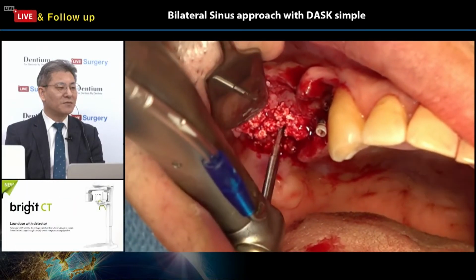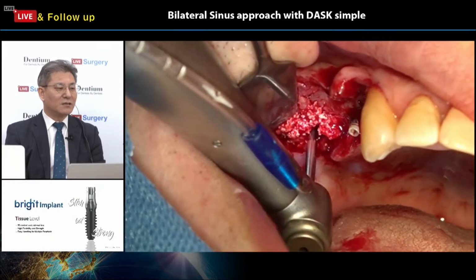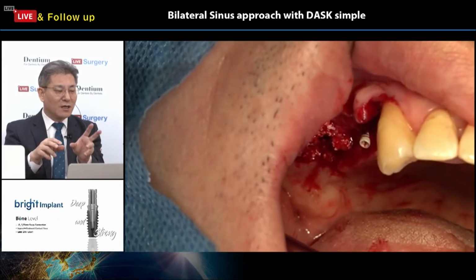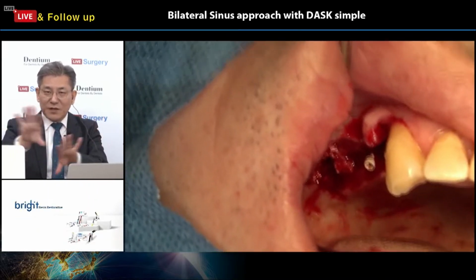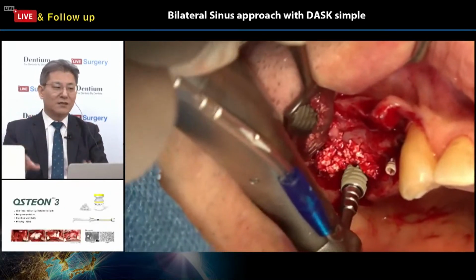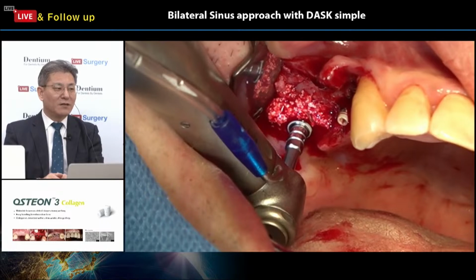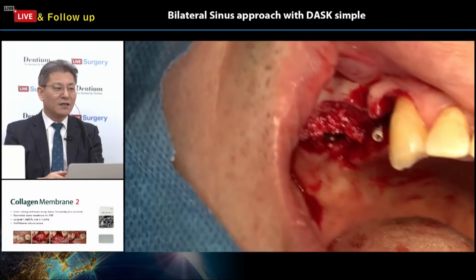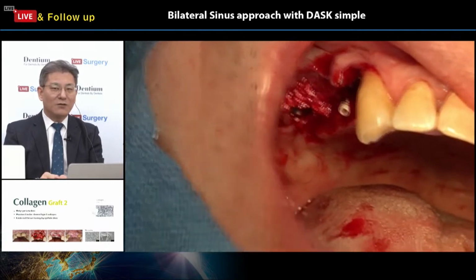This one is a graft spreader. It is one of the options. The purpose of using the graft spreader is to spread the graft materials into the sinus cavity in different directions. However, for me, I prefer to use the depth gauge, a small, round shape, accurate.